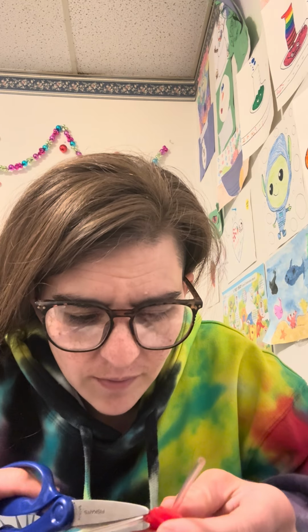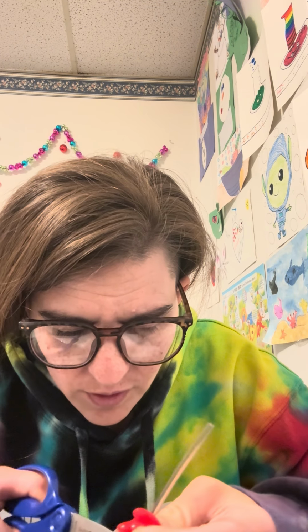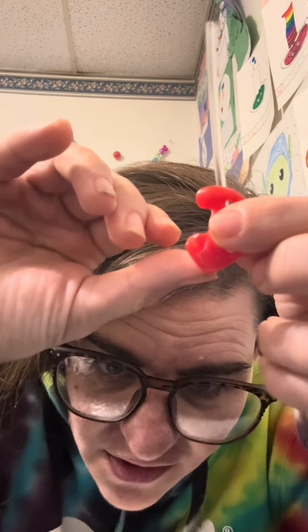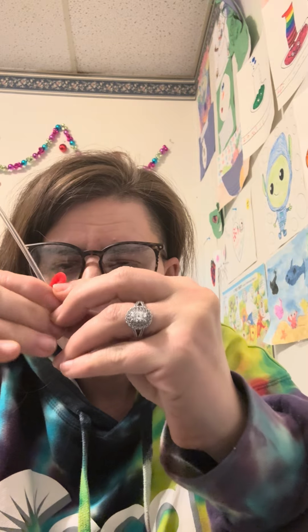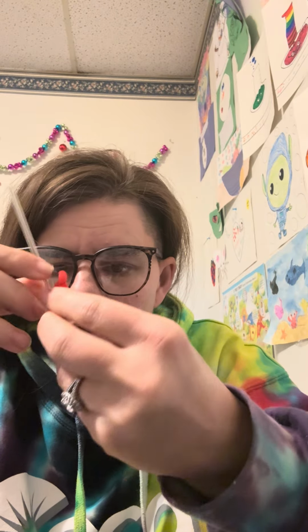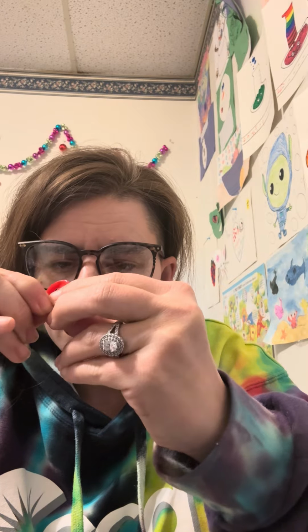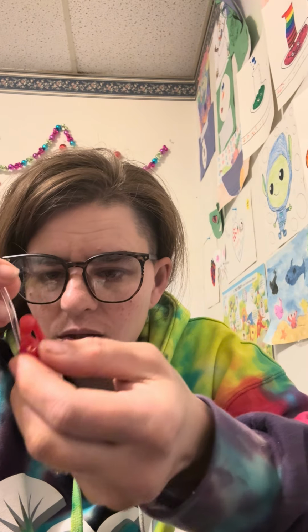So let's cut it. And then I usually pull it through a little more than I need, because then there's always this little edge. Can you see that little piece that sticks out right there? And then I can just pull it back a little bit. So that way I don't have to worry about cutting it all the way. And then my tube is in the mold, and then it's also like that. So you want to make sure that your lock, if you're using one, is all the way in the mold. If you need to do any more trimming, you can do that at this time.